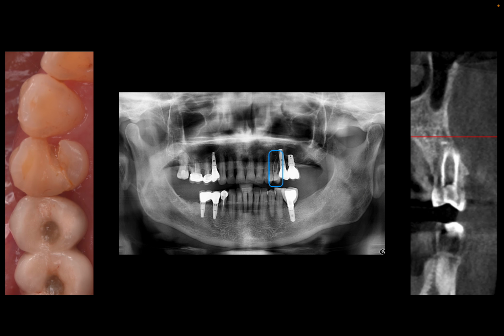So, this is the case that I will share with you by commenting on the surgical video, because we have a surgical video, to understand how important it is in situations like this one, especially when we have the absence of buccal plate or we have a preserved buccal plate, how important it's going to be to preserve the original architecture from the beginning by doing atraumatic extractions, right?